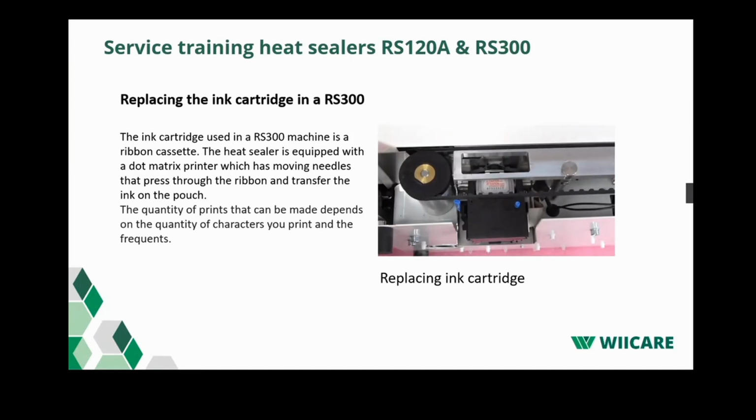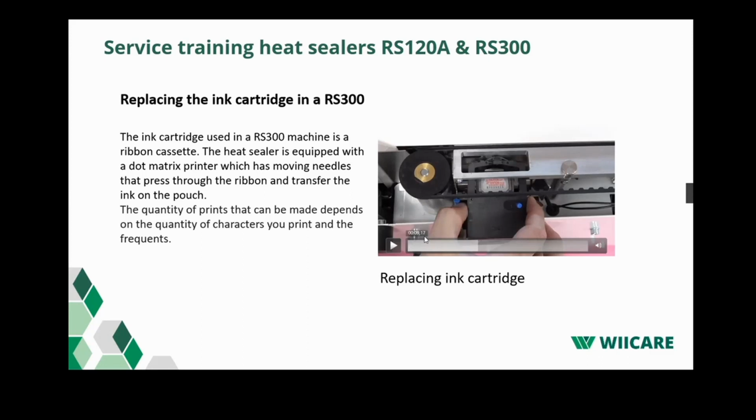To remove the old cassette, you have to pull it towards you on the top sides at the arrows. Then push the cassette upwards through the hole so you can also pull the bottom out. Quite often we get a question about what the left blue knob is doing. It's doing nothing. It doesn't do anything to the adjustment of the printing head or the print cartridge. The only blue knob which is important is the knob you see in the video on the right. That's to move the ribbon.